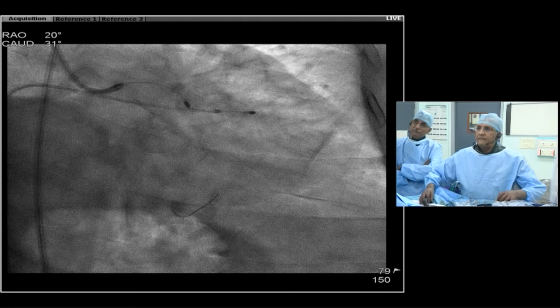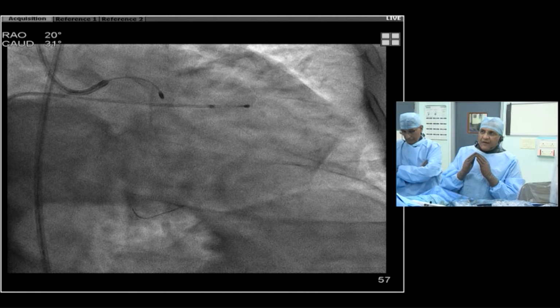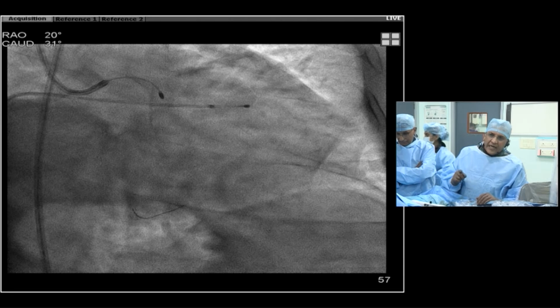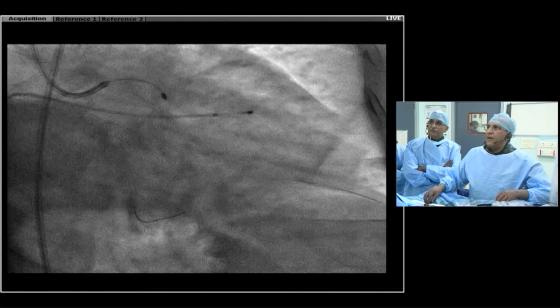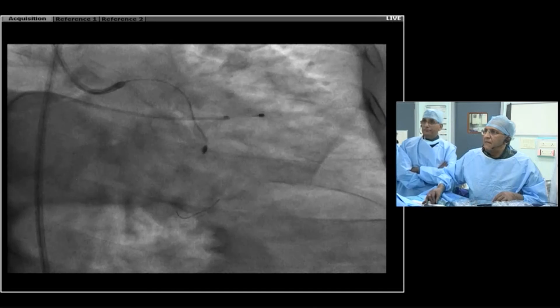You need a what? Say that again. So you could put in a very heavy metal like platinum, and that would not do that because of the circumferential spin, it's like pottery, it just opens up. But if you use a very strong metal that doesn't do that, then one of the metals will yield, and the second metal, the wire, will yield because it's stainless steel. So they had to have a softer metal than stainless steel so that it'll give way. Got it. But the point is, I misspoke. It's not that the diamonds get messed up, but you lose your ability to advance. So sometimes switching the burr later makes sense. The burr shape goes.